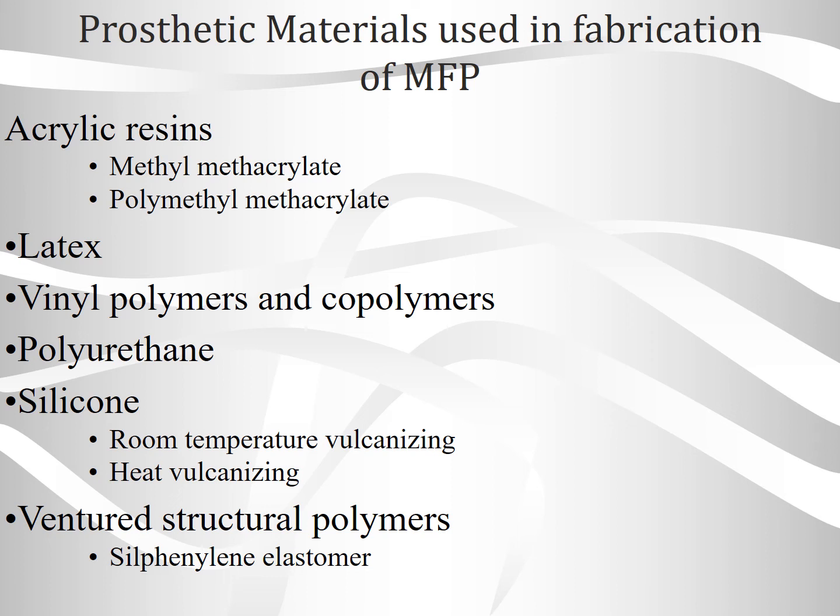Then comes the polyurethane, and then silicone, which are room temperature or heat vulcanizing. Then comes the venture structural polymers.